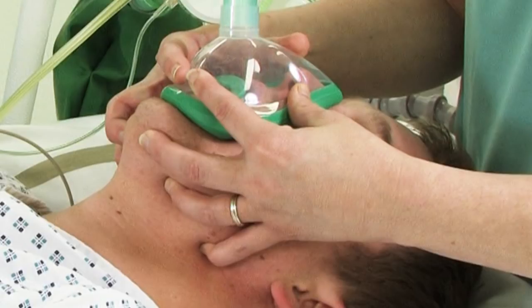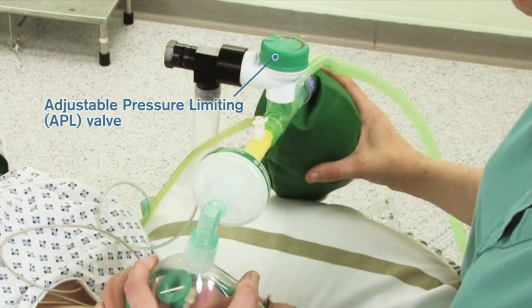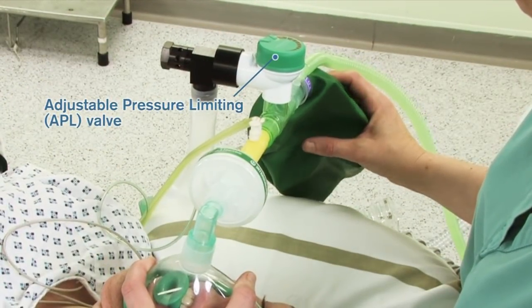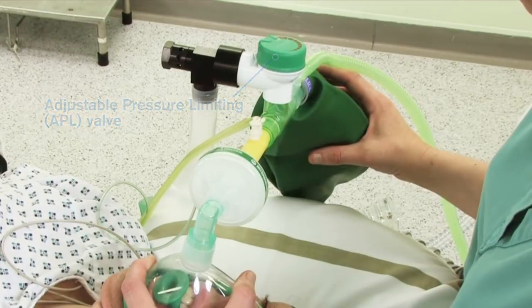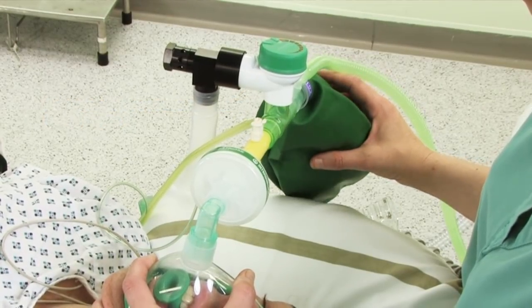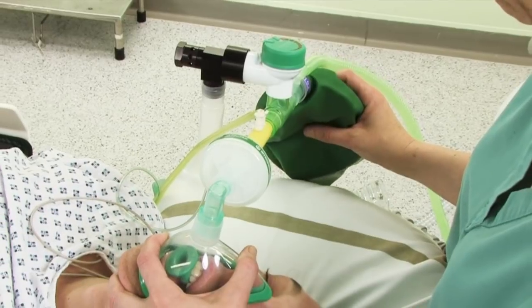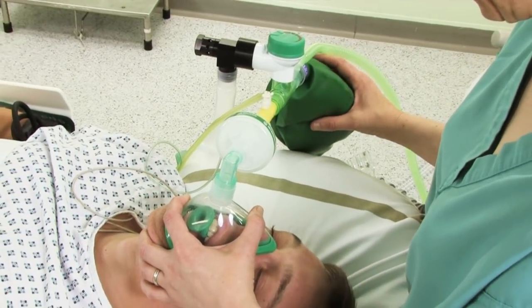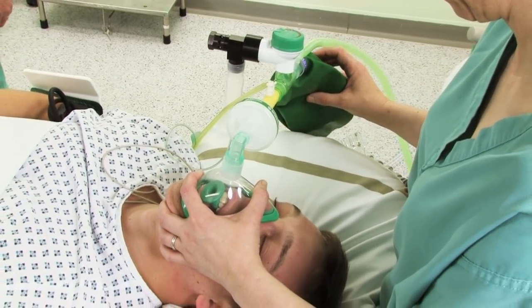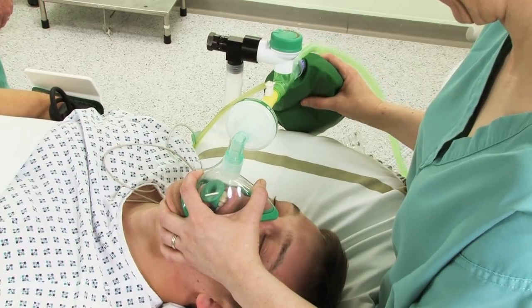The adjustable pressure limiting valve on the anaesthetic breathing system is adjusted in order for oxygen to accumulate in the reservoir bag, and then the bag is squeezed in order to deliver oxygen to the patient. If this technique is correctly undertaken, the patient's chest will rise during ventilation.